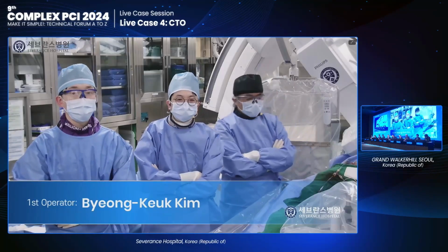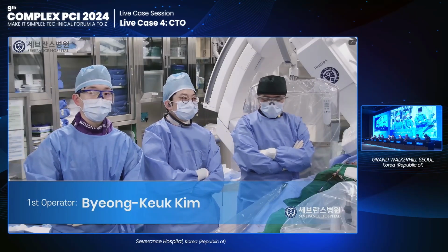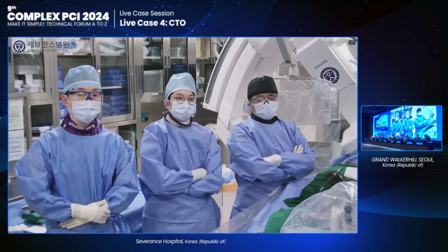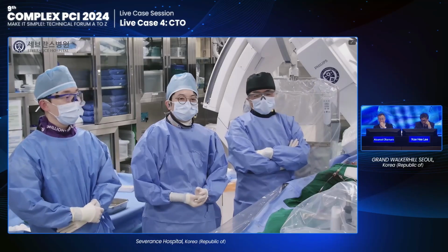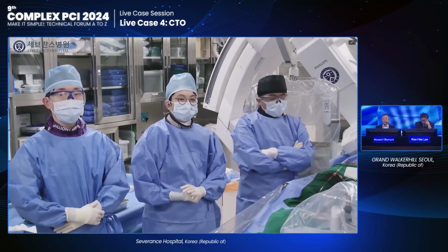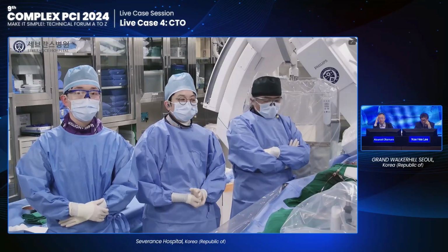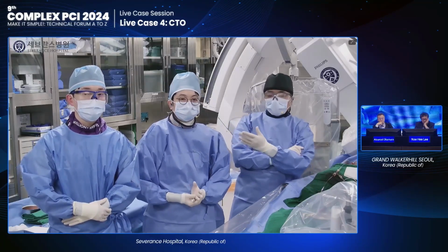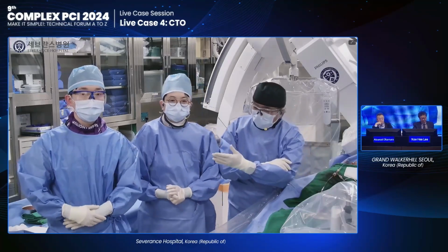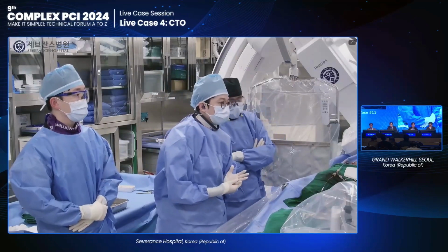So this is the Yonsei classroom. It's a great honor to have a demonstration, and I would also like to appreciate SJ Bach and DW Bach. We prepared an RCA CTO case. Firstly, let me introduce our team. This is Professor Seung-Jun Lee, and my fellow is Dong-Won Kim. So Seung-Jun Lee, could you tell us today's RCA CTO case?